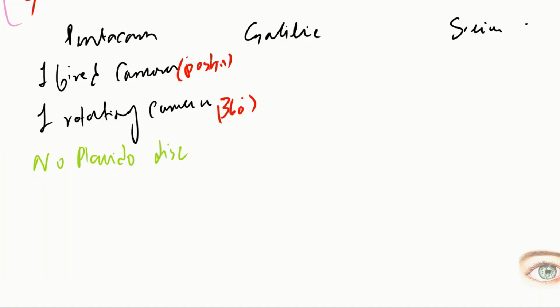This right here is the pupil. This is the iris. Let's say the camera is in this position, it's going to take an image of the cornea, plus it will go inside and take an image of the angle as well.